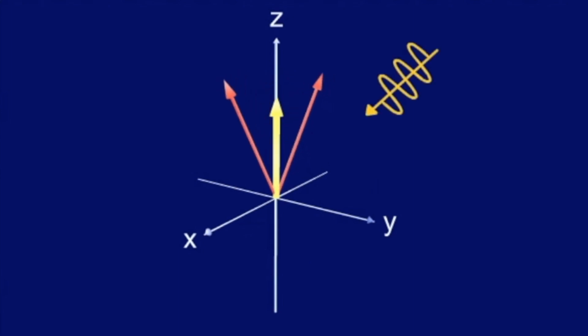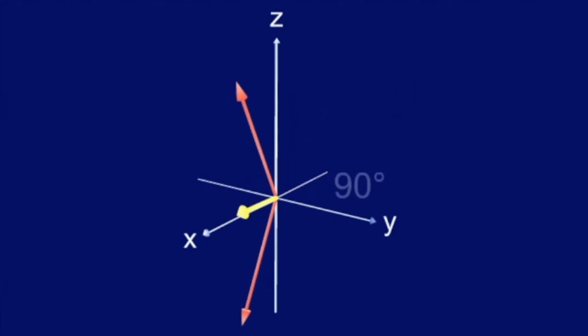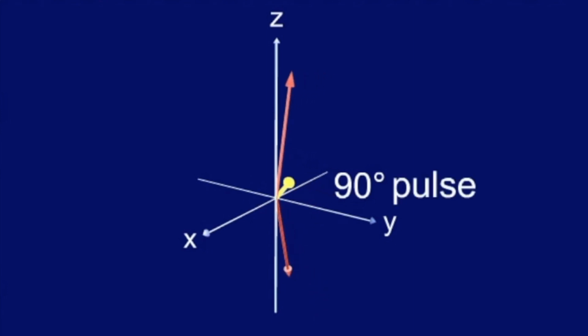The RF pulse tilts the longitudinal magnetic vector 90 degrees to the side. Such an RF pulse is called a 90-degree pulse. Naturally, other RF pulses are also possible and are named accordingly. For example, 180-degree pulse.